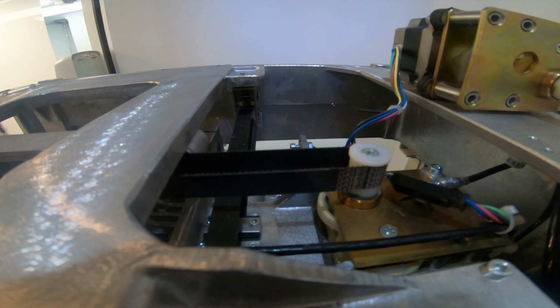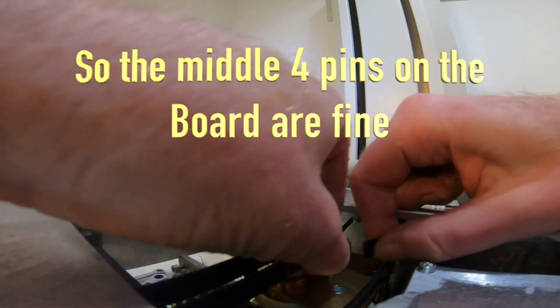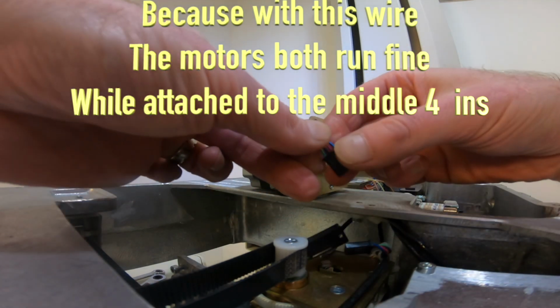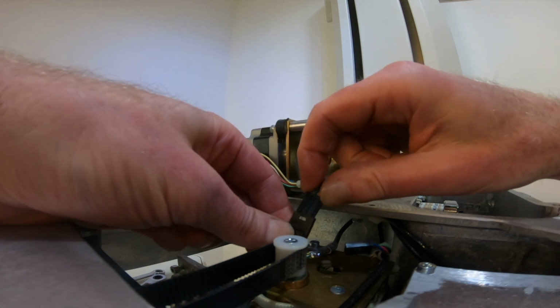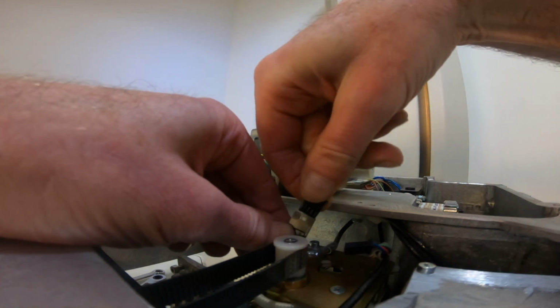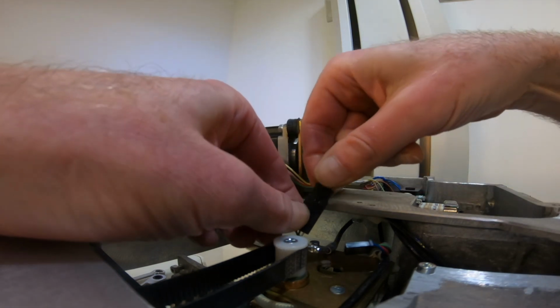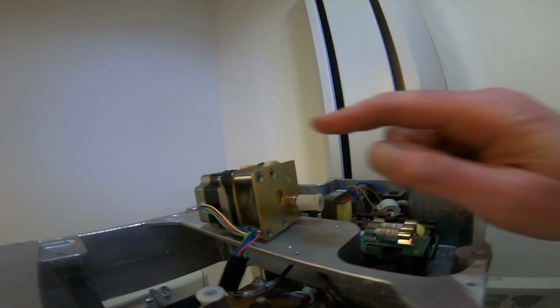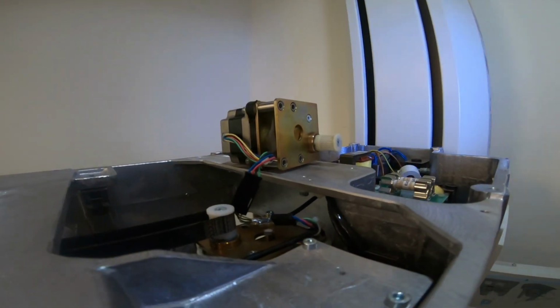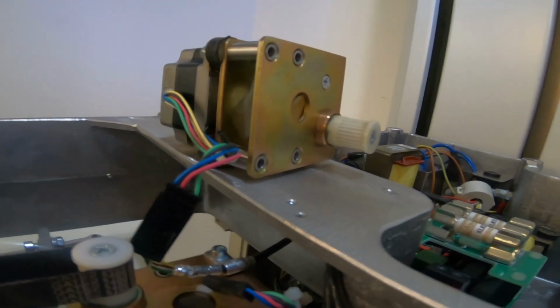Now to truly make sure it works, we're going to use that same motor right up there, the same motor that didn't work a second ago, coming from the good Y leads on the circuit board, and using the bad, quote-unquote bad wire. We'll clip it in, and now we're going to push the button, and if it works, which it is, it works fine. So it's got to be the wire.